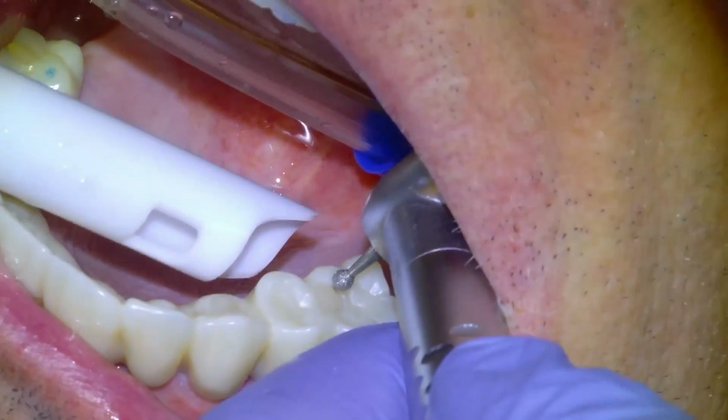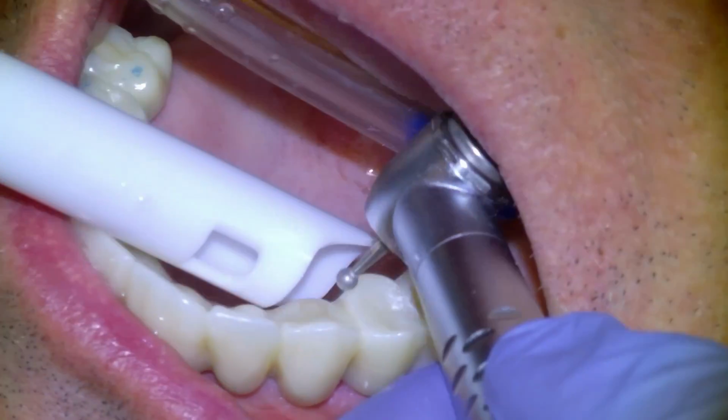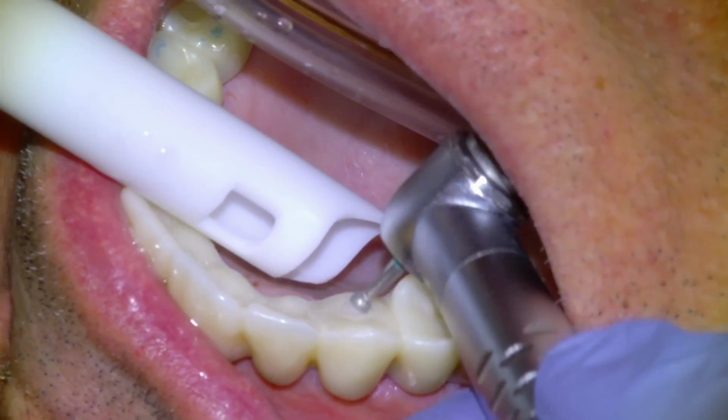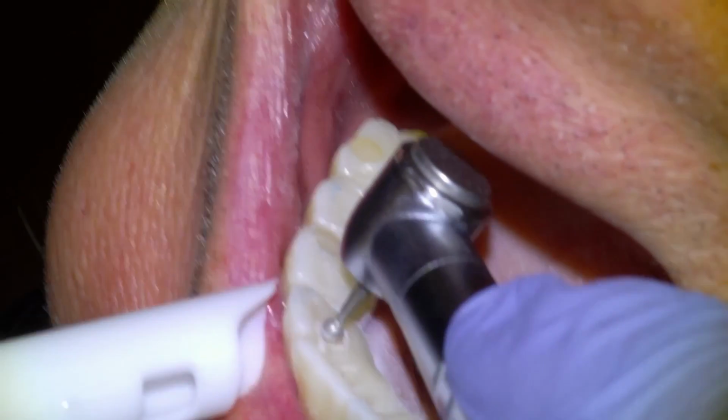So we have plugged up the screw channels, and then we're going to trim back the composite filling material with a high-speed burr, and then this thing's ready to go.